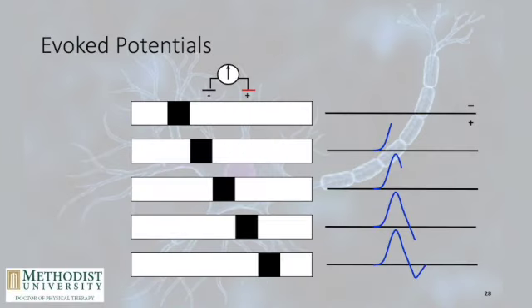This slide is simply showing you how the waveform correlates to timing. If I have a large time between the time I stimulate and the time I catch it, I'm not going to see a big wave. If there's a little bit of time between the time you throw the electric and the time you catch the electric, there's going to be a big wave.